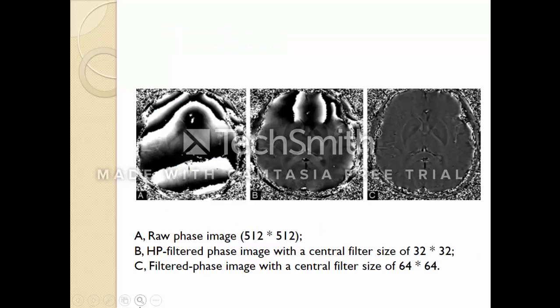So the effect of the high-pass filter can be observed in this image. In image A, the raw phase image is shown, and then when we apply the high-pass filter with different sizes, we can get a reasonable image, and it can be quite illustrative.